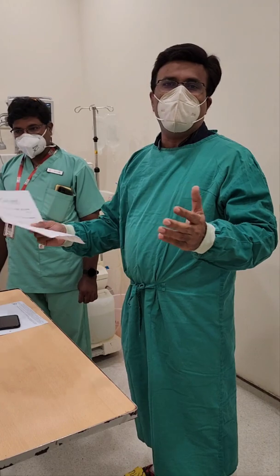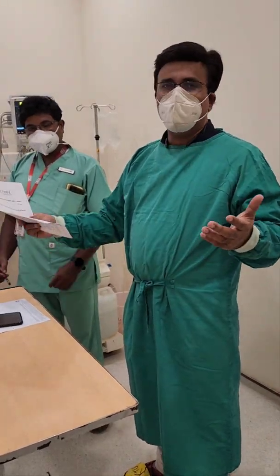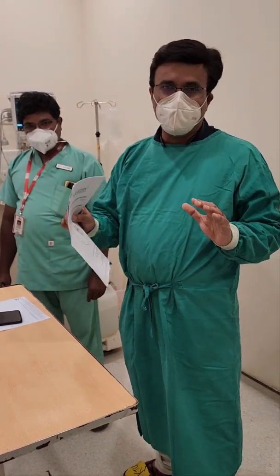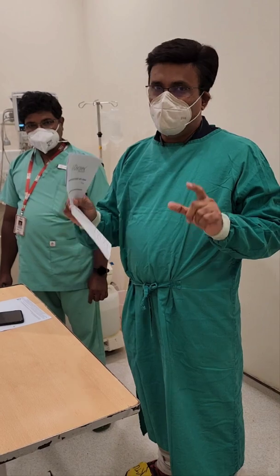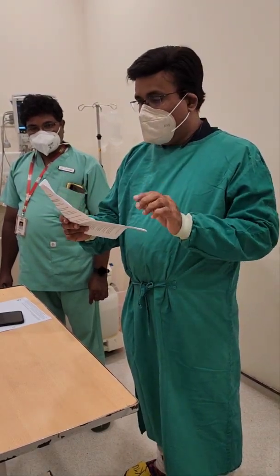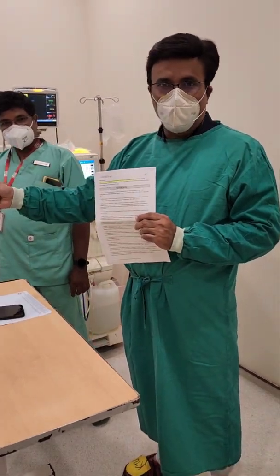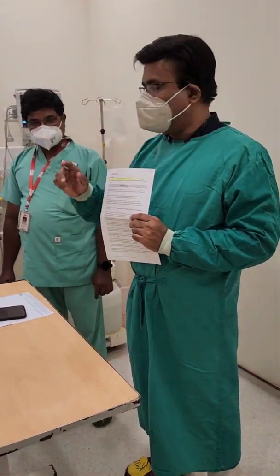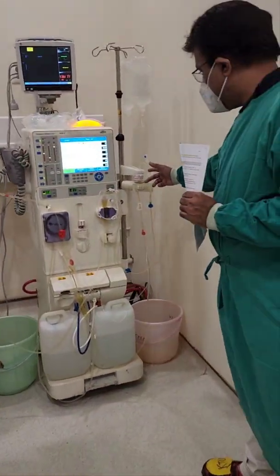As you know, plasmapheresis is often performed as a non-specific method of removing antibodies. But in our case, what I am going to talk to you about is removal of blood group specific antibodies with the help of ABO glycosorb columns. In our case, our patient is O blood group and our donor is A, which is why we have used A columns.